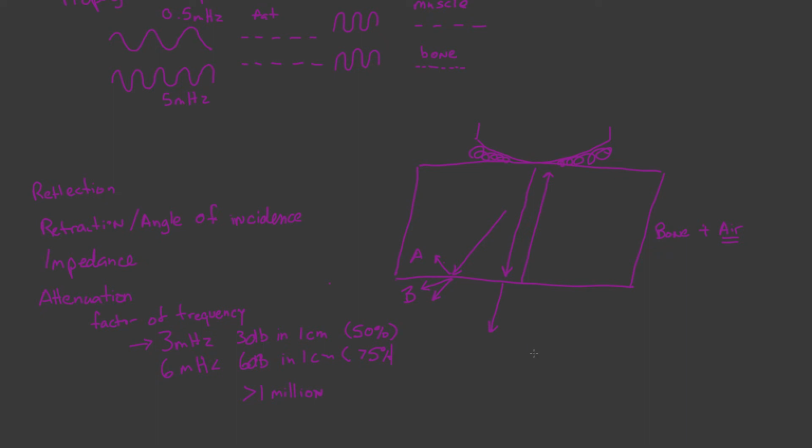So your higher frequency probe will actually give you better resolution than your low frequency probes, but you sacrifice depth as a result of that.